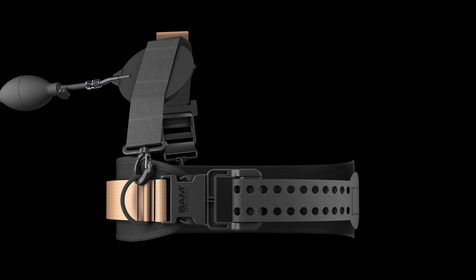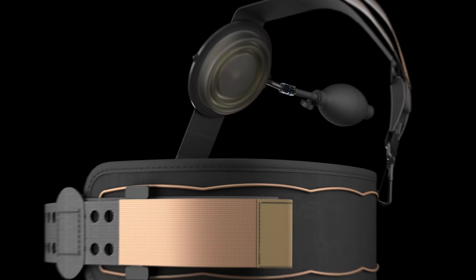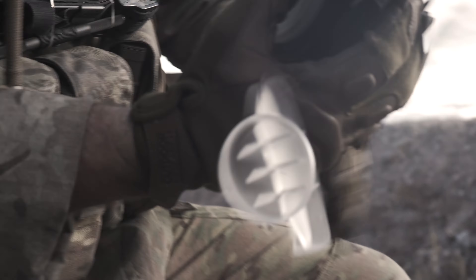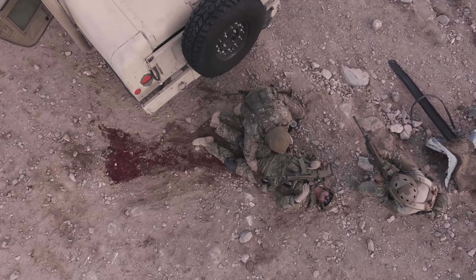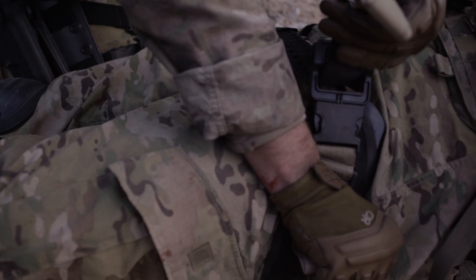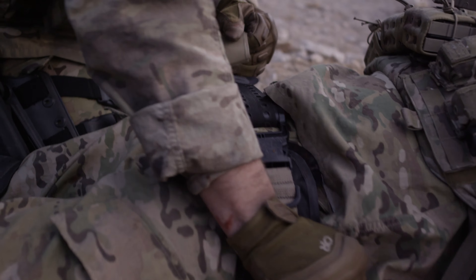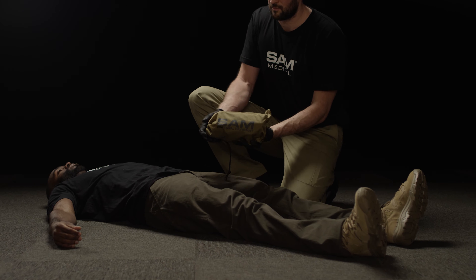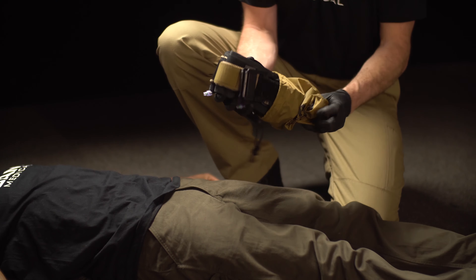This is the Sam Junctional Tourniquet by Sam Medical. The SJT, as it's also known, is made up of five components.